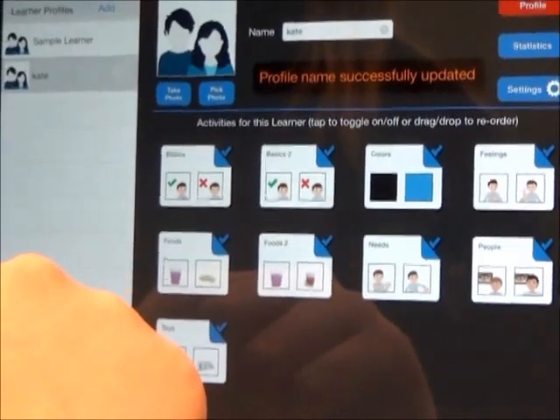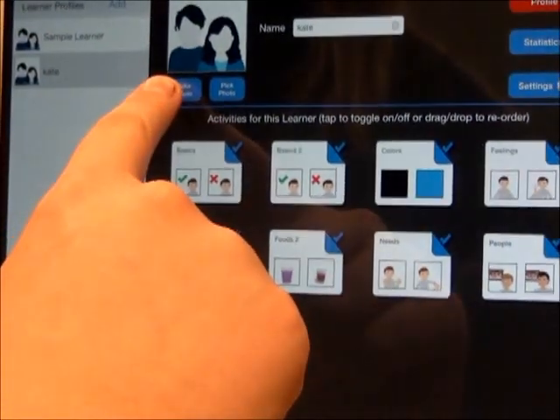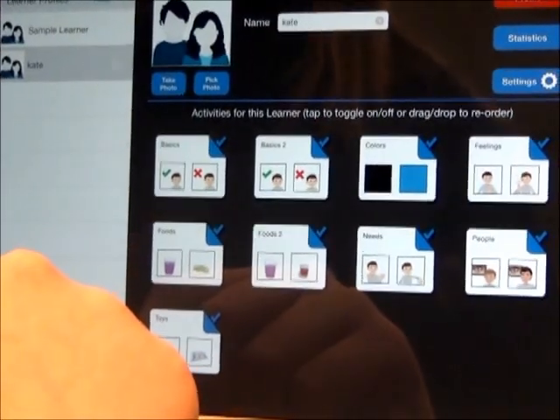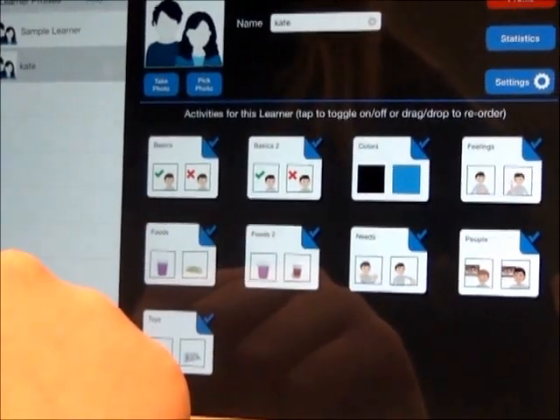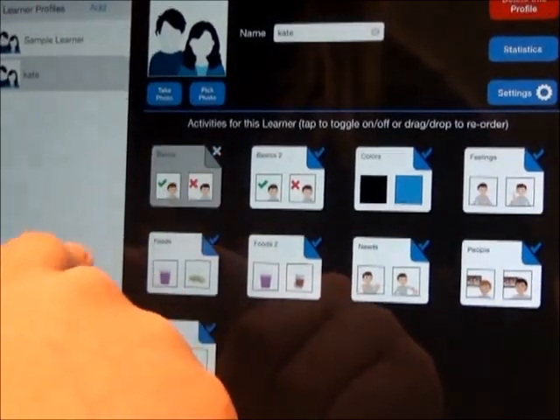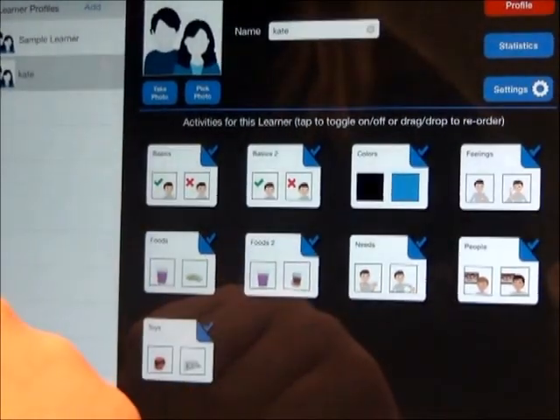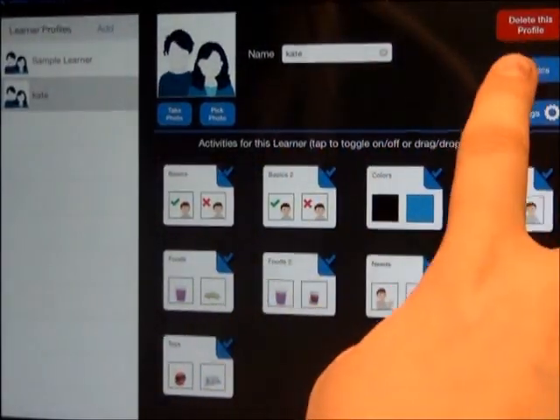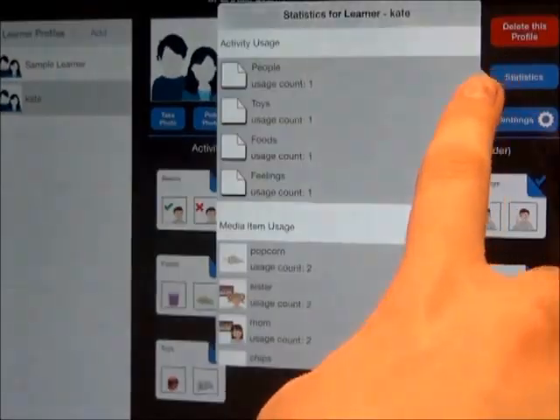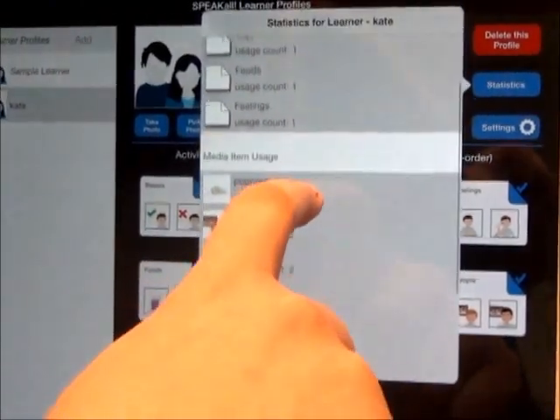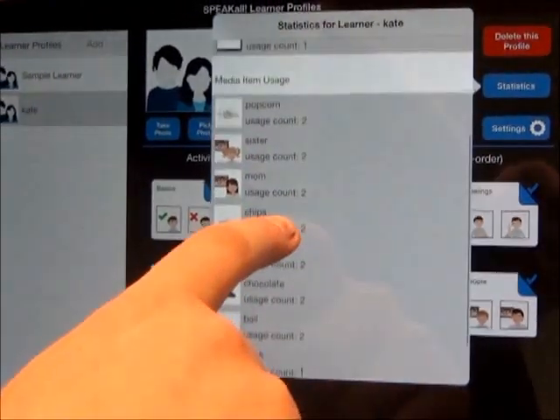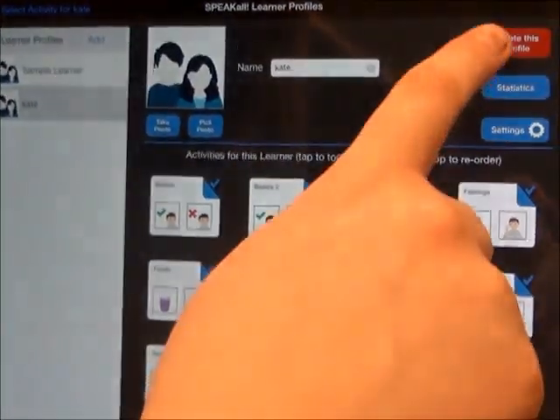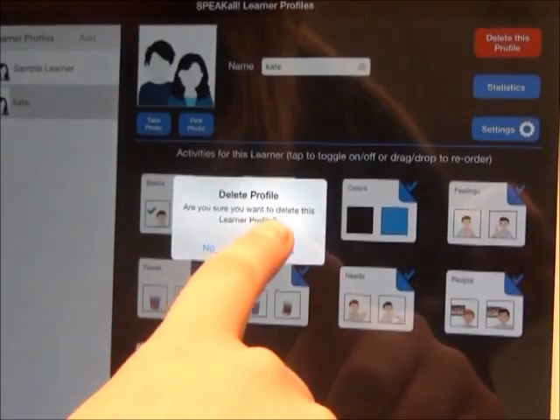Or you may edit the picture by selecting Take Photo or Pick Photo. On the learner profile, you may activate or deactivate activity sheets by tapping the check mark or the X. To review statistics, select the Statistics button on the right-hand side. This shows how many times the activity and media items have been selected by the learner. To delete a learner profile, select Delete This Profile, then select Yes.